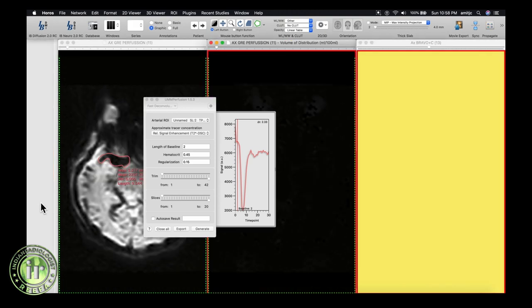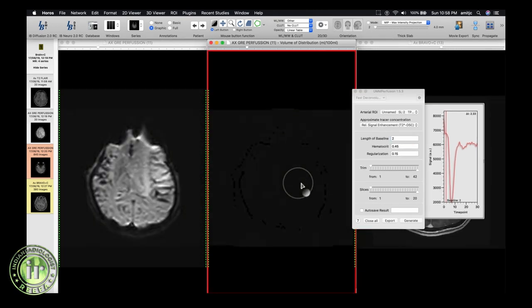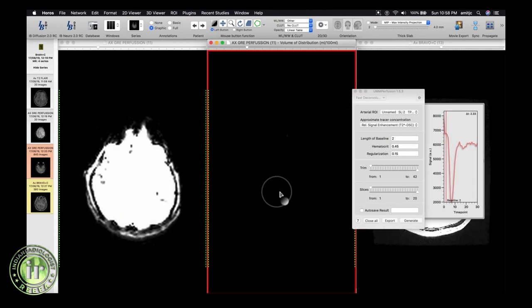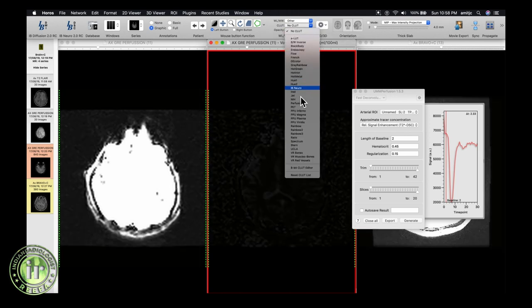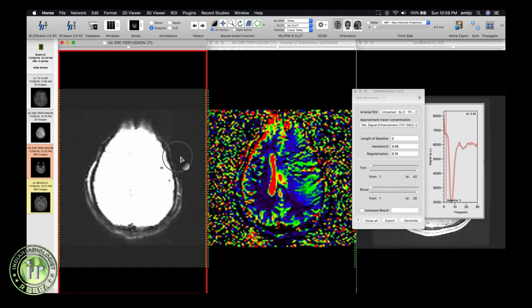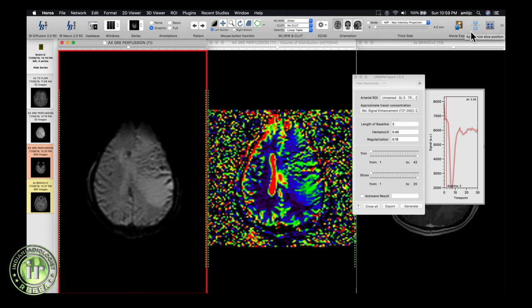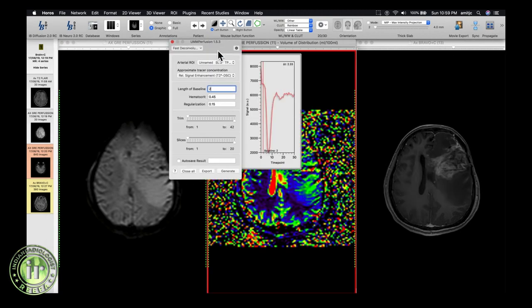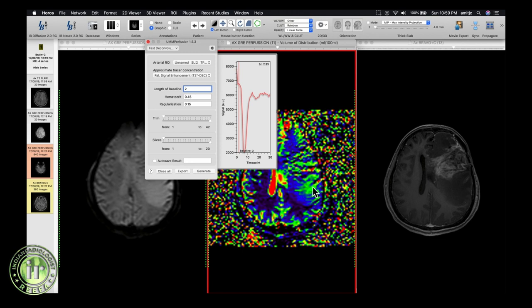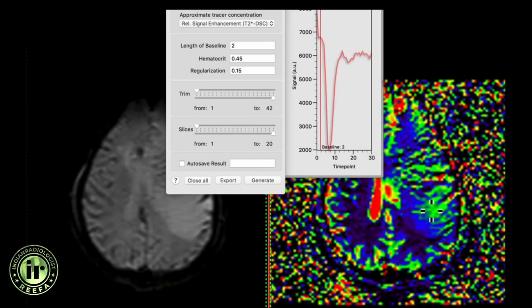You can open the contrast-enhanced sequence for comparison or for defining ROIs in the region of the tumor. Change the windowing so the cerebral blood volume map is properly visualized. Select a color lookup table with rainbow color view and adjust the map to get a proper perfusion color map. Adjust the contrast or window settings on the native perfusion image, then sync all images. Draw an ROI on areas showing high CBV levels appearing in green and red hues, using an open polygon or oval ROI.